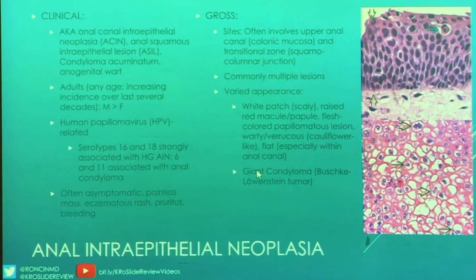And the giant condyloma or Buschke-Lowenstein tumor is just kind of something to keep in the back of your mind. And they are absolutely massive, massive lesions. Okay, so what do we have in pictures?